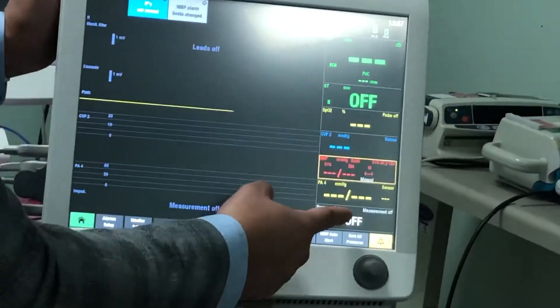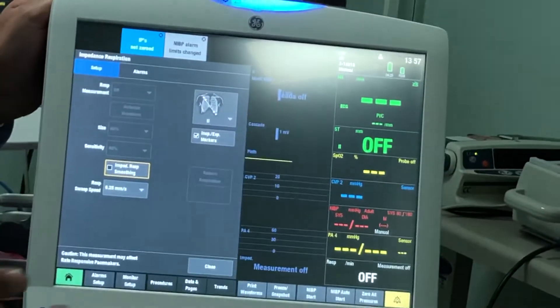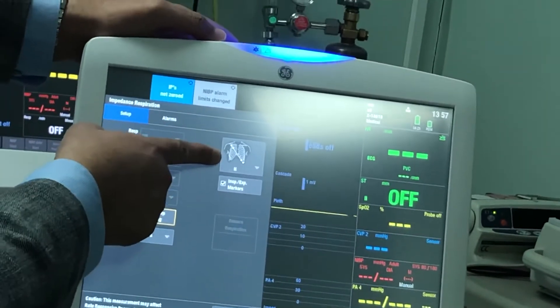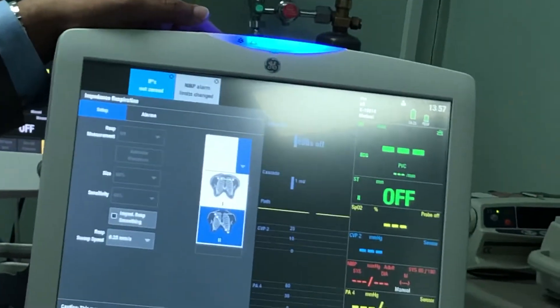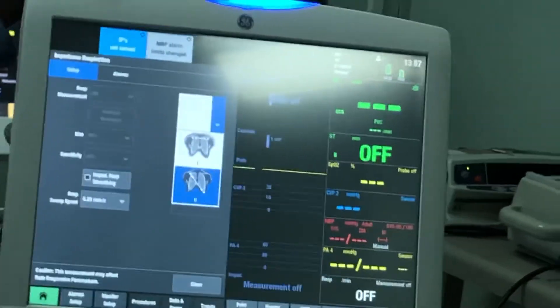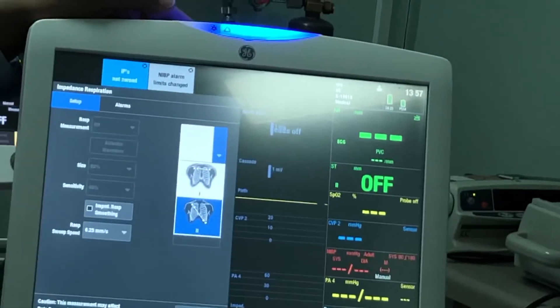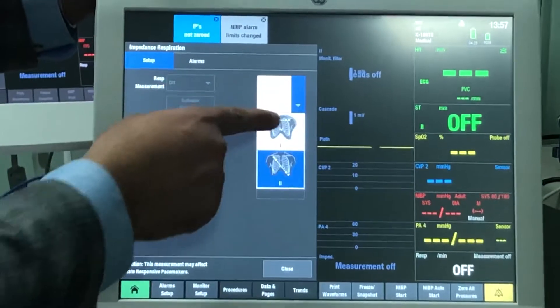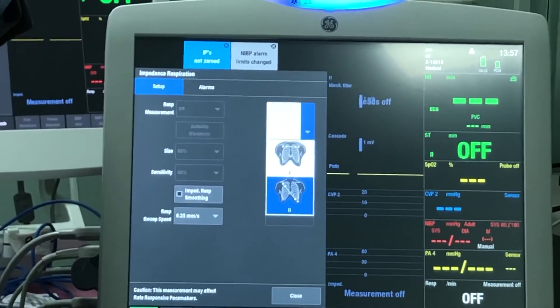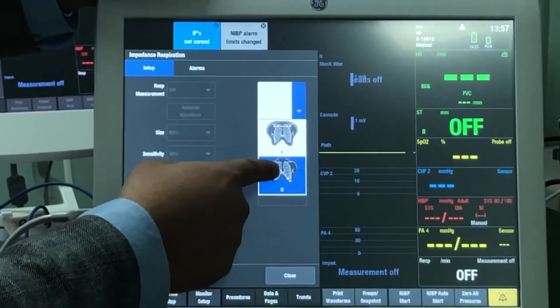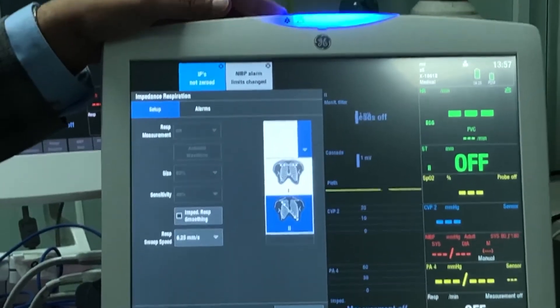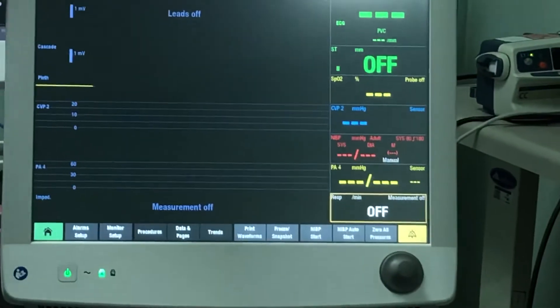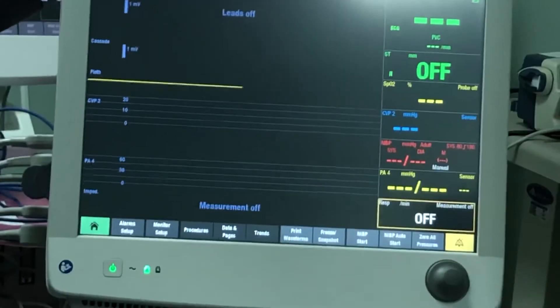You can set alarms for systolic, diastolic, or mean blood pressure. The same applies to any other parameter. For respiratory rate, pressing on it shows its settings. The measurement method is through impedance from the ECG leads — you can choose which lead configuration to use for impedance measurement.